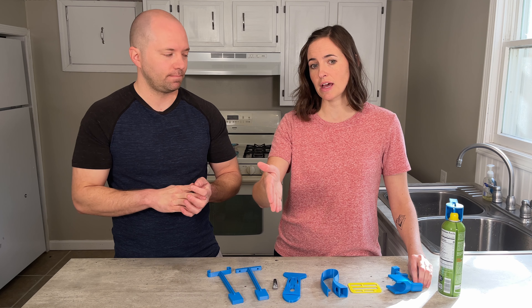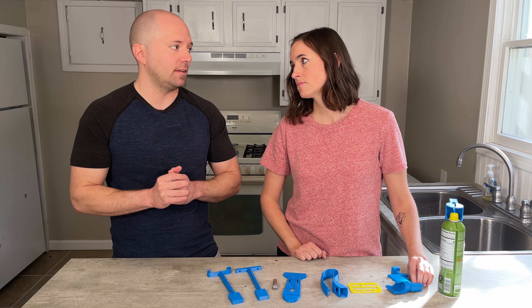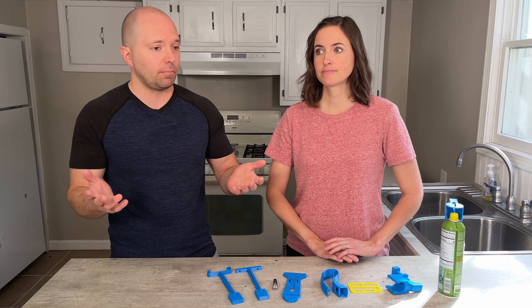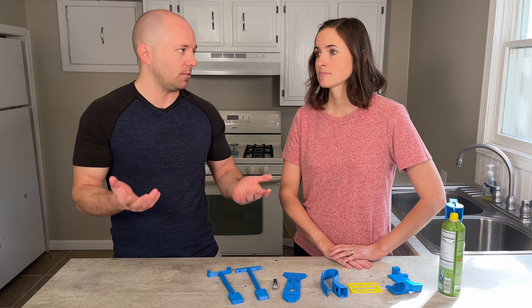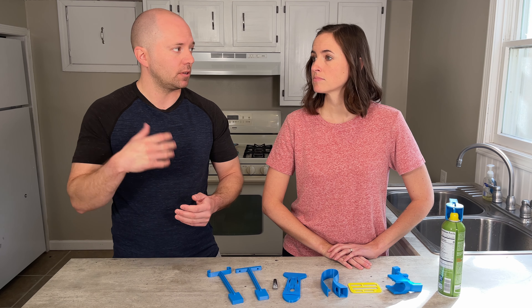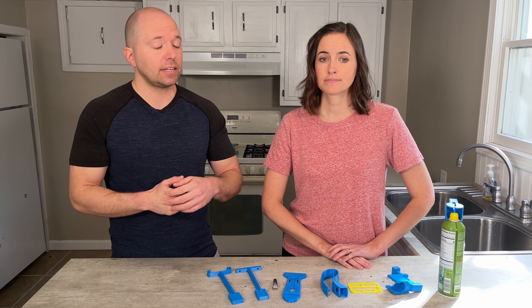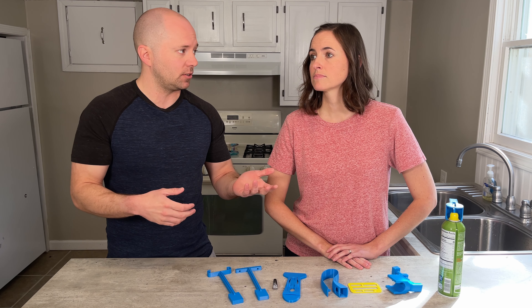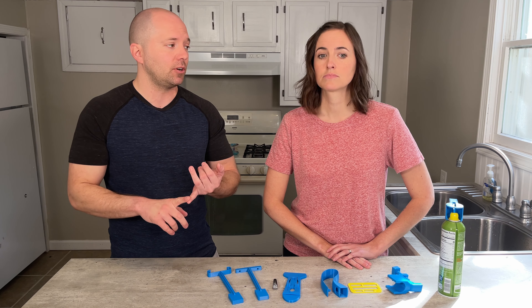So let's say you've found a 3D model you want to print and it looks like a good design — now how do you go about getting it printed? If you don't have a 3D printer, the easiest option is to see if you have a family member or friend who has one. 3D printers are very available now and many are inexpensive, so you may have someone who has a 3D printer at home and some filament, and you could just reach out and ask if they'd be willing to print the model you found.